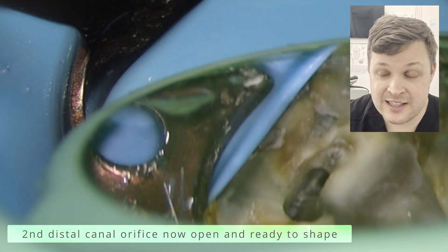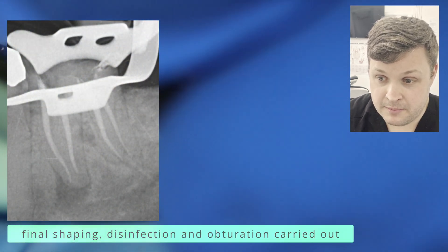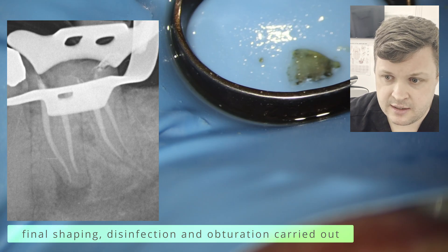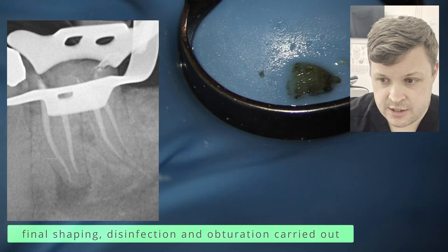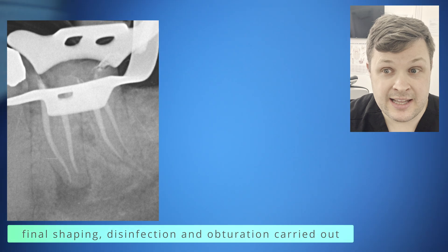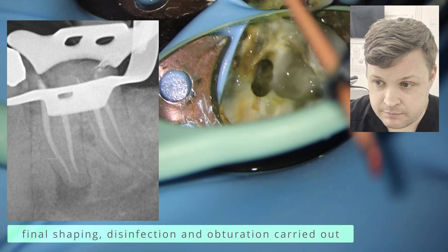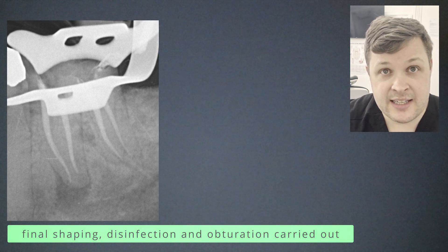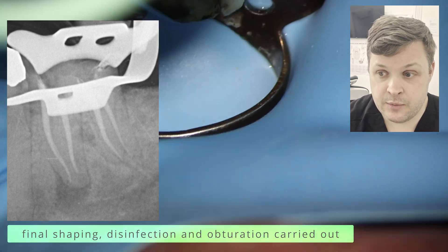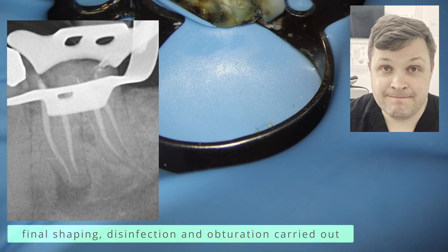The final result looks super nice, and this shows the benefit of using a microscope — using loupes in this case would have made finding this canal virtually impossible. On the post-op radiograph it looks really really nice. The mesiolingual there — the obturation on the left root — did look short, but on the apex locator it was showing zero, so we know for definite it's to length. For obturation, I anticipated using warm vertical compaction, so I needed a sealer compatible with heat — I used AH Plus in this case.